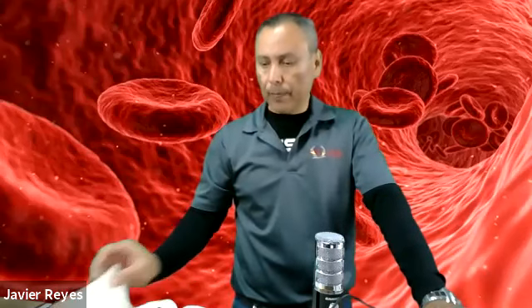Again, one half to two thirds of the slide has to be filled. It has to be spread out, and the edges have to be feathered, or a very, very thin layer. That is the only way the technologist can have a good count of the cells.